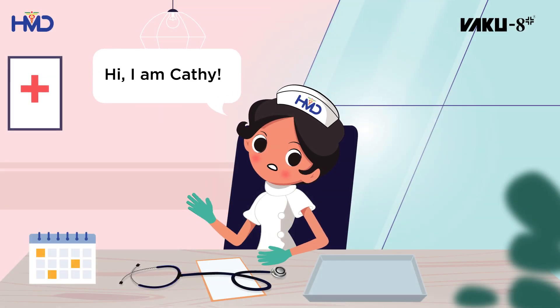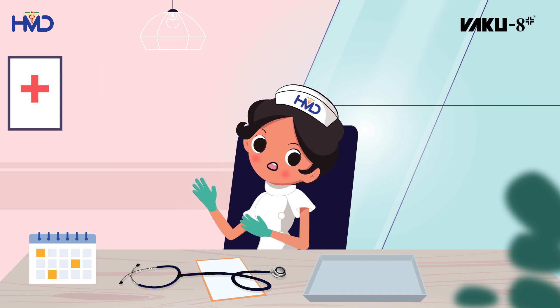Hi, I am Kathy. Today we will learn about user errors that occur during phlebotomy and how to avoid them.